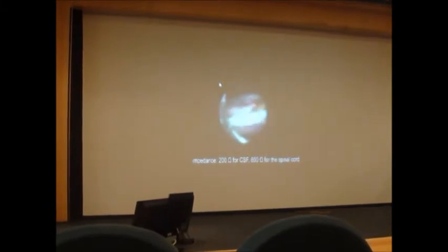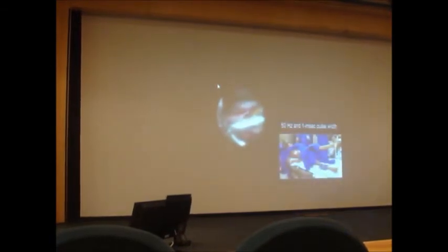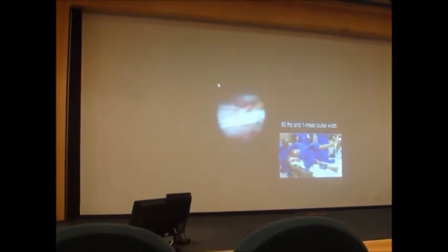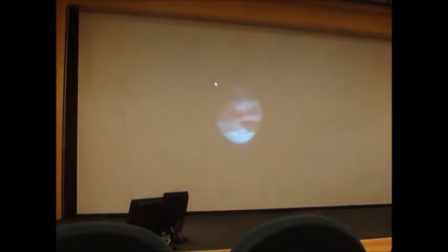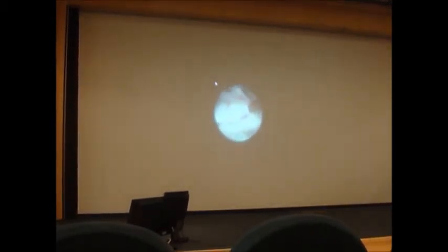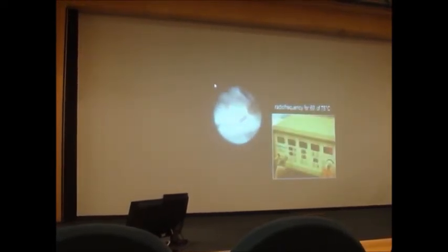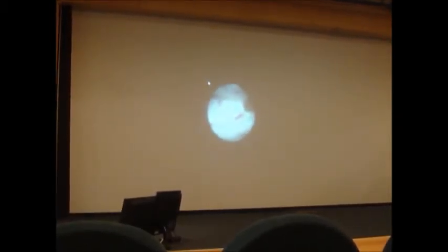At first we introduce the electrode, and once introduced, we begin with electrical stimulation. This stimulation should produce sensory alterations, but not motor alterations. If you are producing motor alterations, it means you are too posterior, in the corticospinal tract. It means contractions of the neck or the upper limb. And then we do a radiofrequency lesion, performed for 60 seconds at 75 degrees. It's a thermocoagulation lesion.